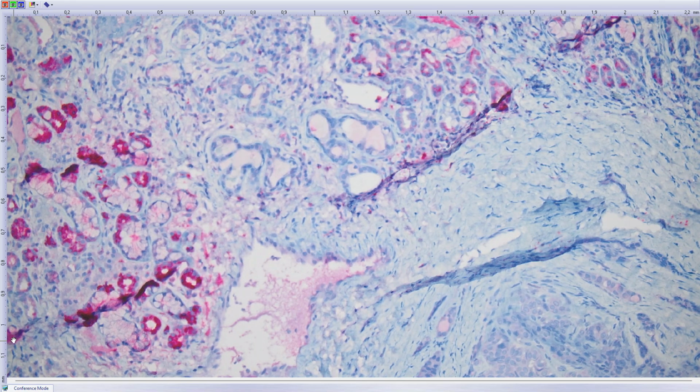Without genetics, I would be sure that it's this tumor. And this tumor, cribriform carcinoma, we described for the first time 28 years ago, and for 20 years it was a huge fight whether the tumor is part of polymorphous adenocarcinoma of minor salivary gland or whether it is a self-standing tumor. This tumor very often metastasized at diagnosis, which is very different from polymorphous low grade. It is radiosensitive, practically patients never dying of it.